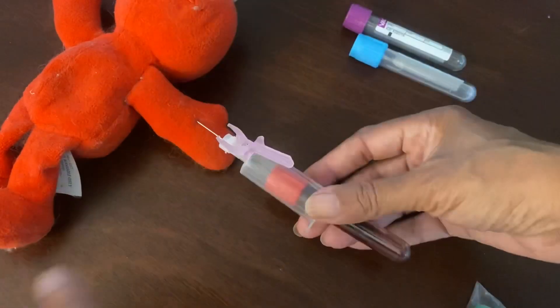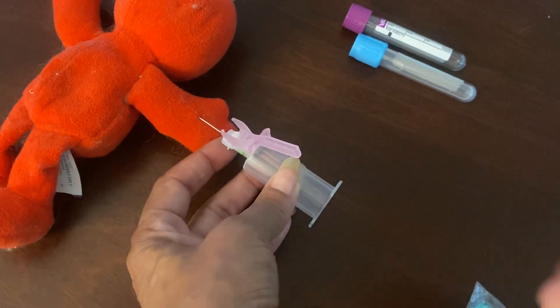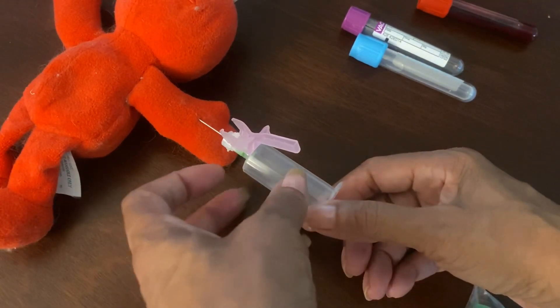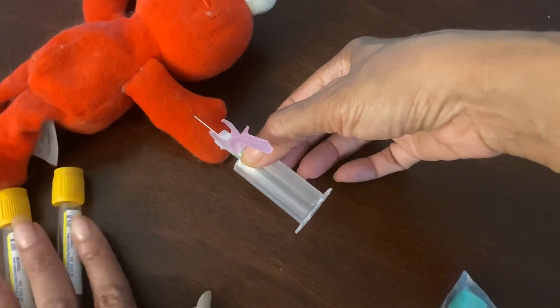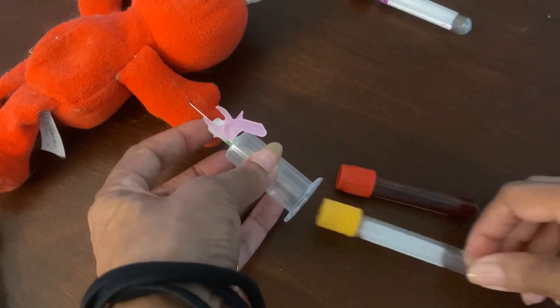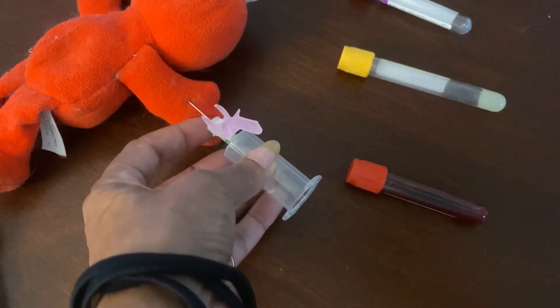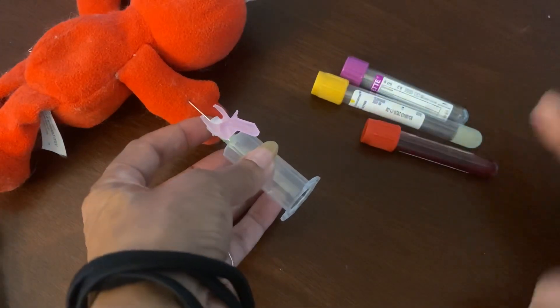It's just too much confusion if you don't switch, because it would be awkward either way. So stick with your right — this gives you leverage, it gives you stability, and now you have everything on the side that you need. Vice versa: if I stuck with my left hand and I want to hold with my right, then I have everything on the opposite side and I can make adjustments and move things around the way that I need. The reason I switch hands is because this is my dominant hand — all of my supplies are over here. It's easier for me to insert and remove the tubes with my dominant hand.